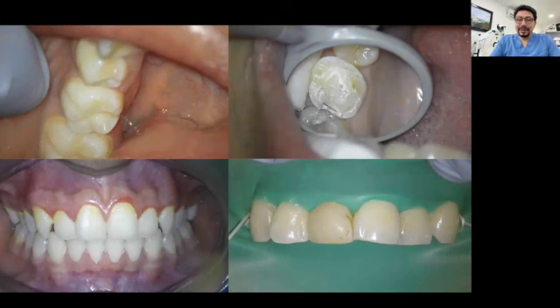Something like this happens when you change your dentistry from a regular dentistry to a clinical practice in which the microscope is helping you. You will have a better understanding of what is happening in the patient's mouth, and having that understanding will help you to have a more precise diagnostic process. And if you have a good diagnosis, of course, you will have an appropriate treatment plan. If we have a wrong diagnosis, our treatment plan will be wrong.